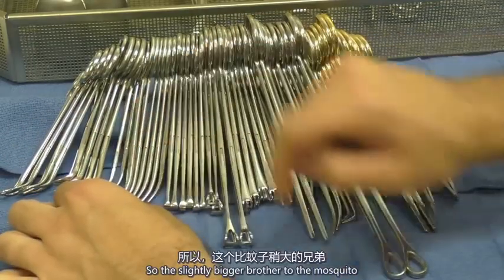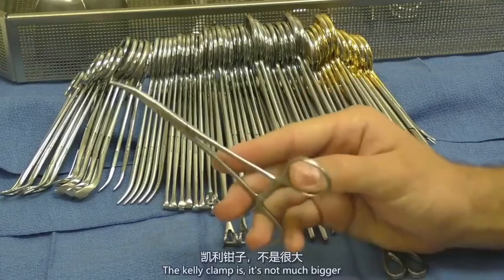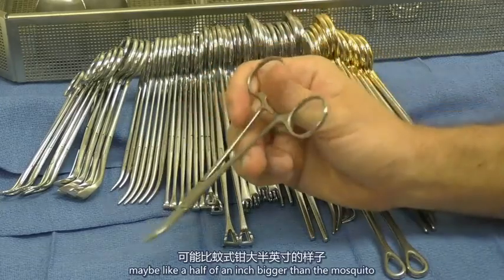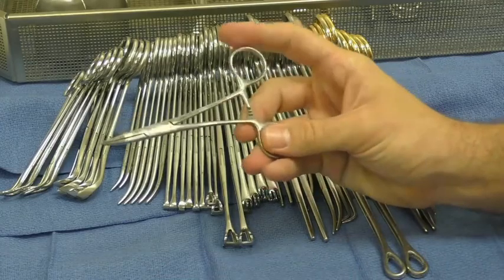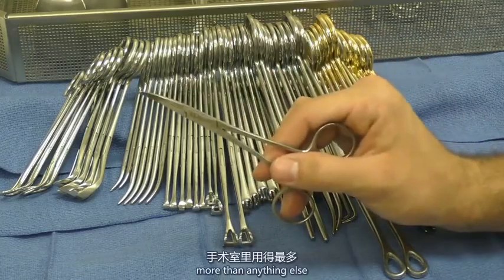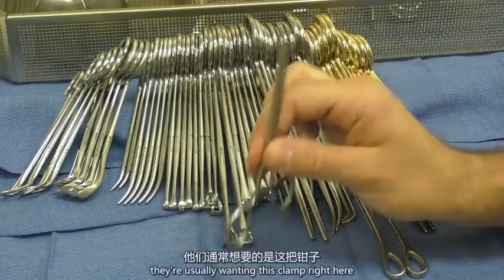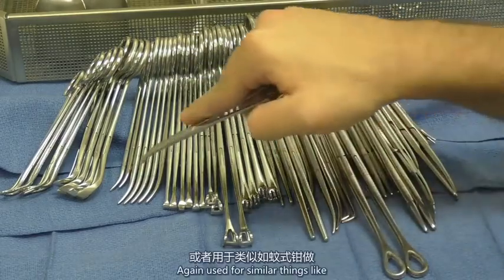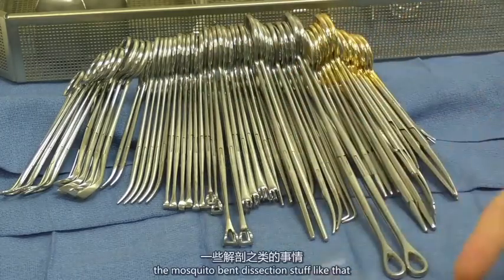So the slightly bigger brother to the mosquito is the Kelly clamp. The Kelly clamp is not much bigger, maybe a half inch bigger than the mosquito. This is kind of like your general purpose clamp. I see this clamp used in the OR more than anything else. If the surgeon asks for a clamp, they're usually wanting this clamp right here. Your general purpose clamp. Again, used for similar things like the mosquito. Yeah, blunt dissection, stuff like that.